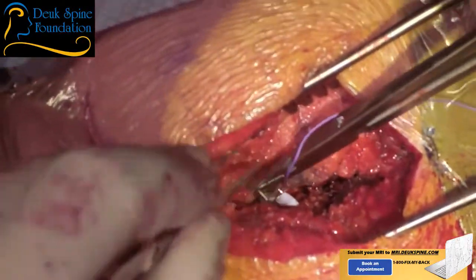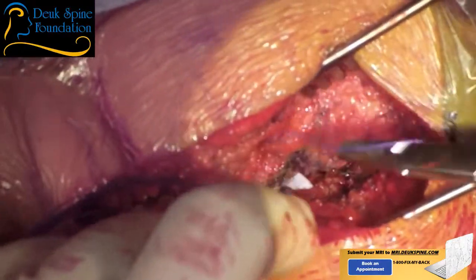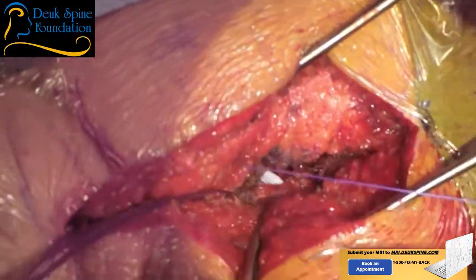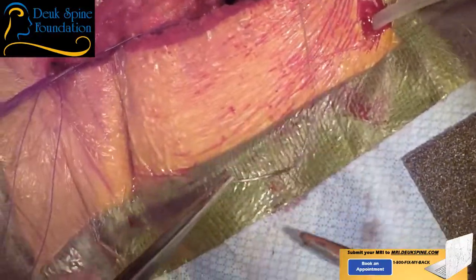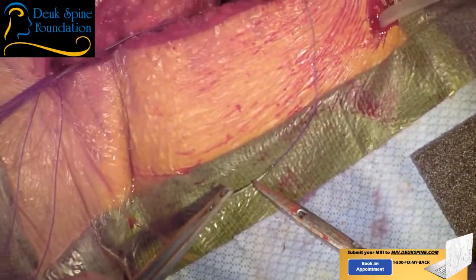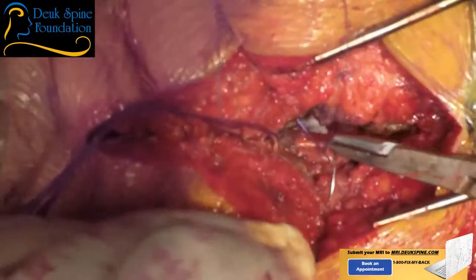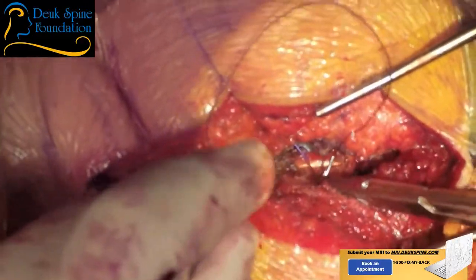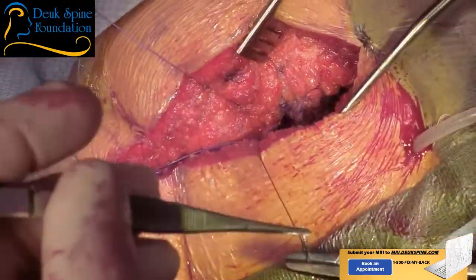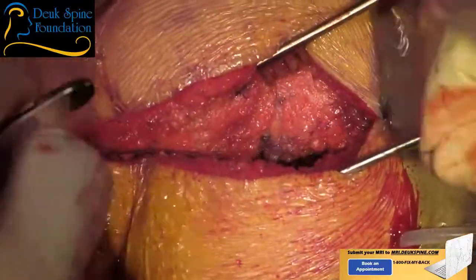Look how dry that wound is, huh? Impressive. It's something that we've shunned away from in the outpatient setting. We're doing ACDFs, some anteriors, some laterals. Well, we're the first in the world to do this outpatient. Posterior has always been kind of a no-no.